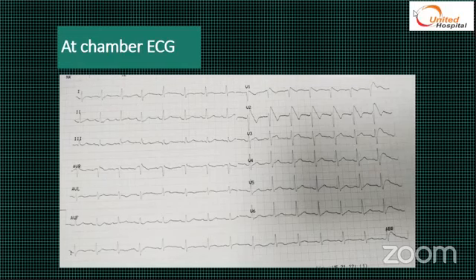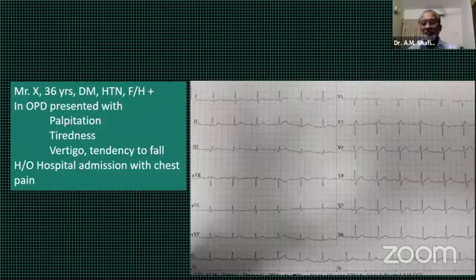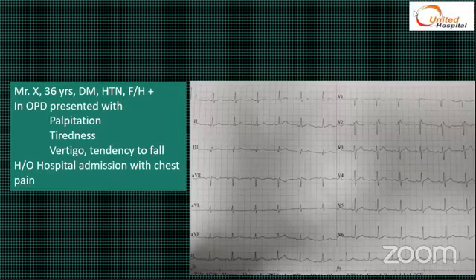Shafiq bhai, can you please go back to the previous EKG? Okay, sir. I just wanted to request all the participants: when you are faced with an EKG, it is a clue. It may not give you the whole diagnosis, and actually in real life, and also in an exam situation or a forum like this, the presenter gives you a clue. If you look at the history, there is a reason why Shafiq bhai has given a very short but very relevant note. Look at how this patient is presenting, and he is giving the EKG. So let's point out how the patient presented, and then look at the EKG.